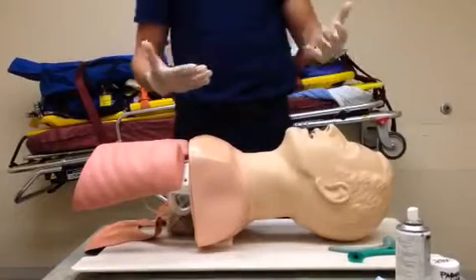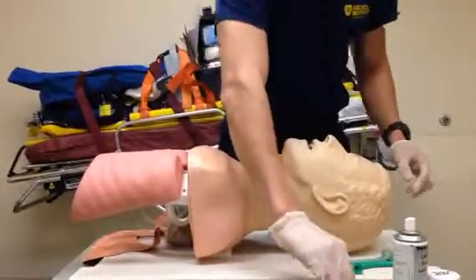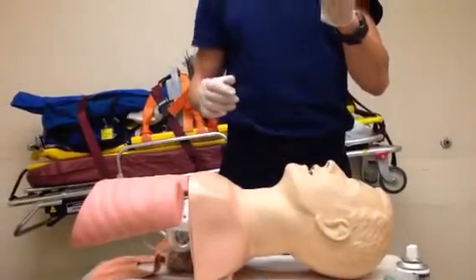For the purpose of this demo I'll be using the lubricant that's indicated for the mannequin. For an actual patient we'd be using Mucogel or other similar product.